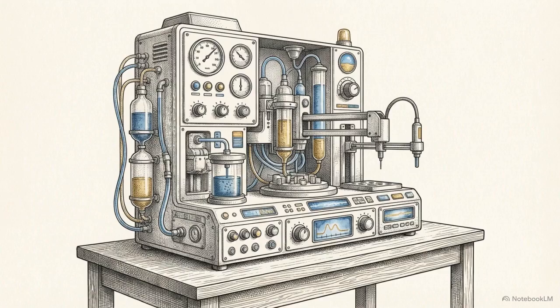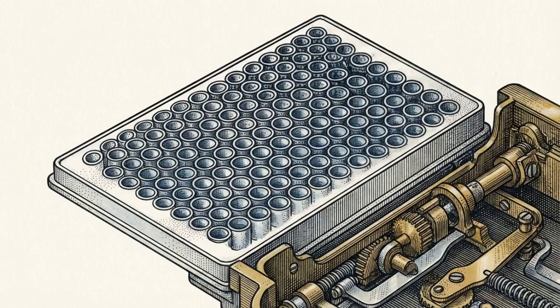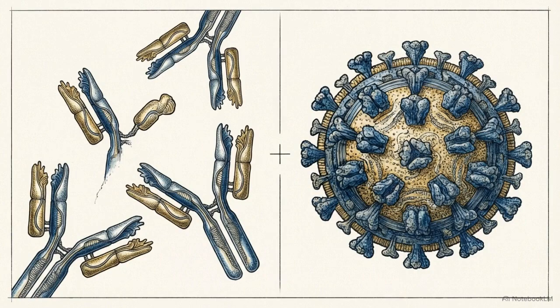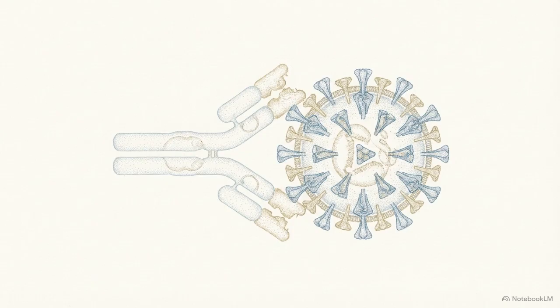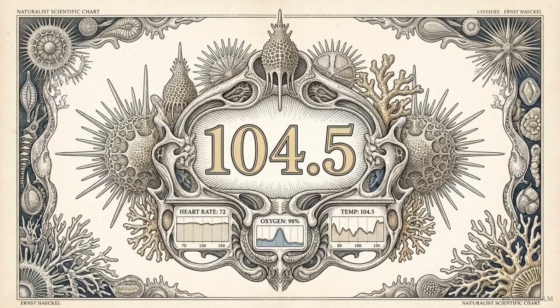Modern assays manipulate this architecture to shrink the window period. A fourth-generation HIV ELISA, for example, is designed to detect both the patient's IgM and IgG antibodies and the P24 viral antigen simultaneously. By looking for the physical virus alongside the immune response, the time it takes to detect an infection drops significantly. The utility of an ELISA is its ability to mathematically translate an invisible molecular binding event into macroscopic, actionable clinical data.